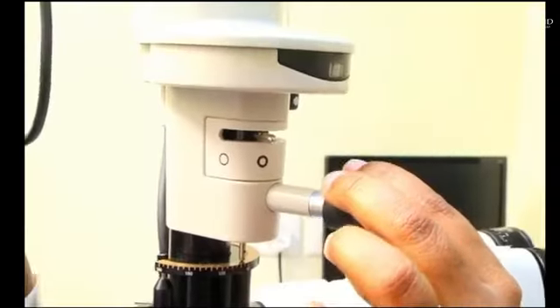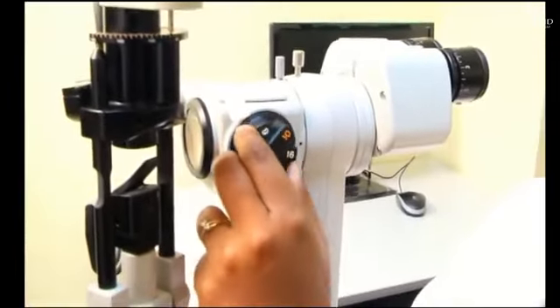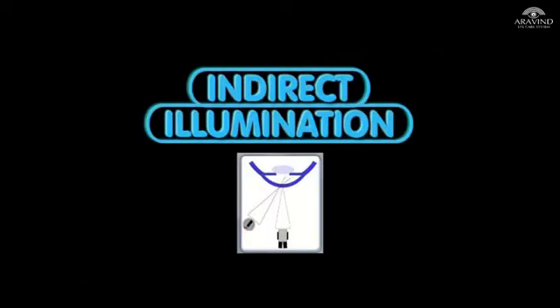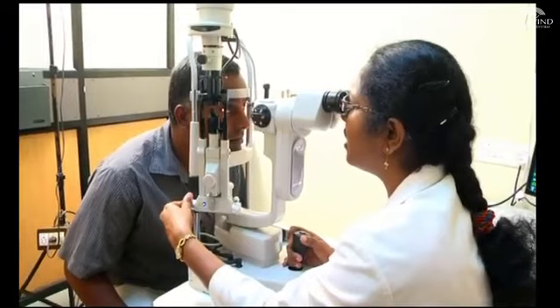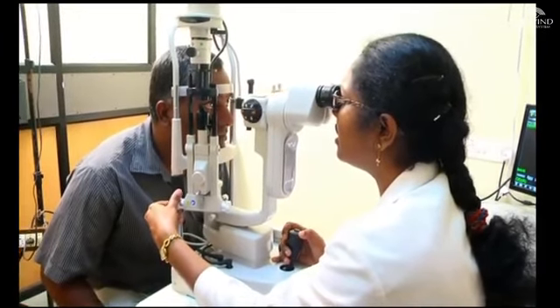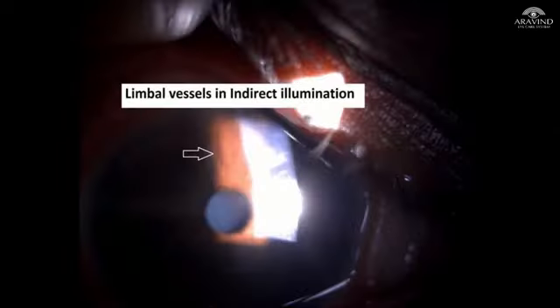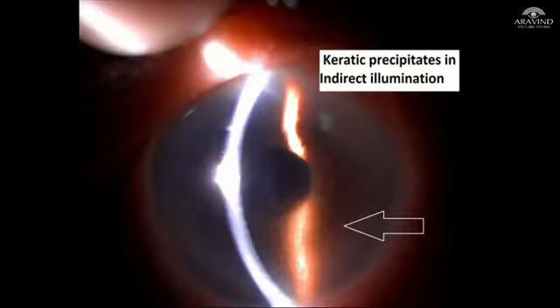Moving on to conical illumination. Here, a 2 mm conical beam of light with 16x magnification is focused on to the front of cornea and just in front of the lens to look for cells and flare in case of inflammation. Indirect illumination, in simple terms, is looking outside the area which is directly illuminated. Few pathologies that can be appreciated are granular deposits on the cornea in granular dystrophy, limbal vessels, keratic precipitates at the back of the cornea.